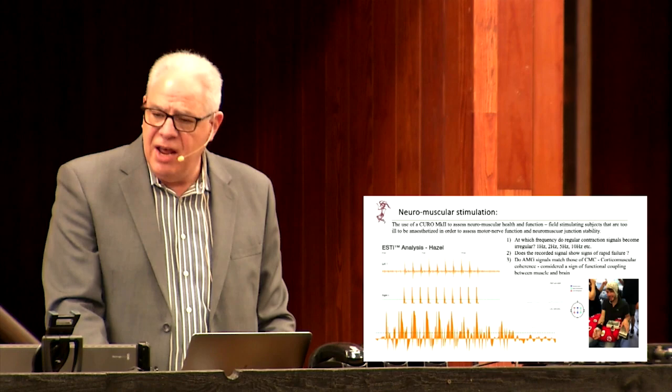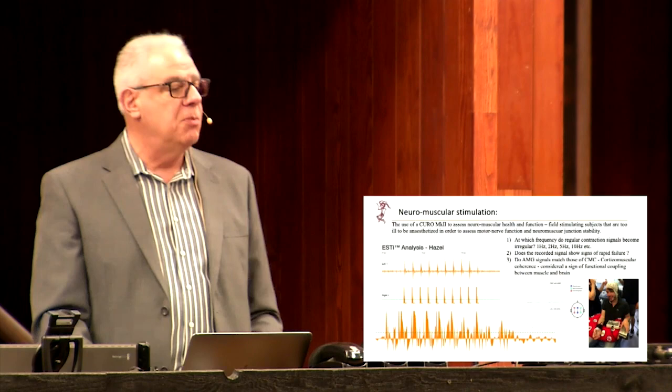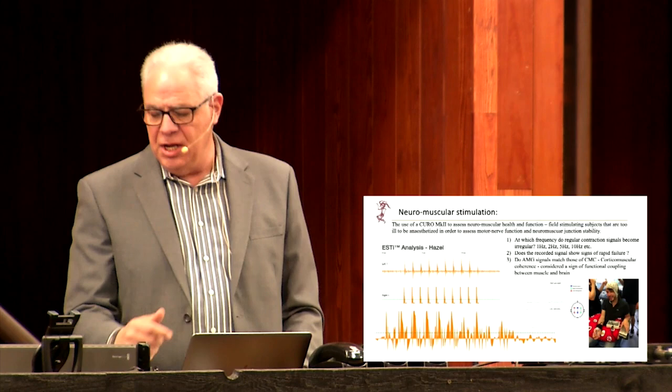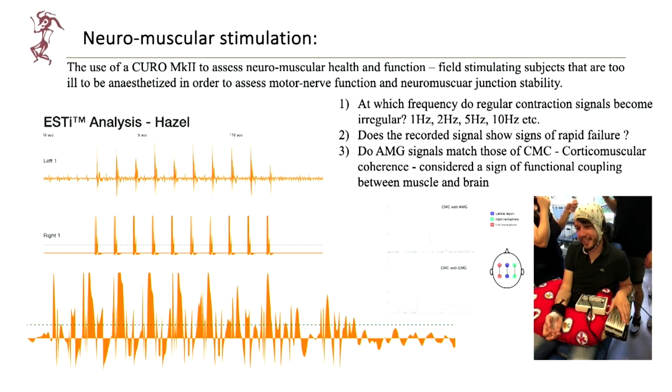In patients that have myasthenia gravis, that's a disease that unfortunately renders them unable to clear anesthesia from the body. And so it is potentially lethal to give someone with myasthenia gravis general anesthesia. What we have been able to show is that the acoustic myography allows us to identify how the muscle fibers are working in the people with myasthenia gravis, and even to the point where, when comparing it to EMG, electromyography, and utilizing what you can see in the picture on the bottom right-hand side, that is a myasthenia patient who's wearing a skull cap, and you can see on the skull cap diagram just to the left of the picture, the different colors for the sensors.